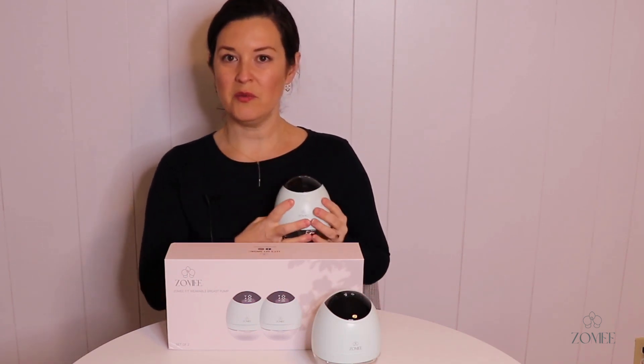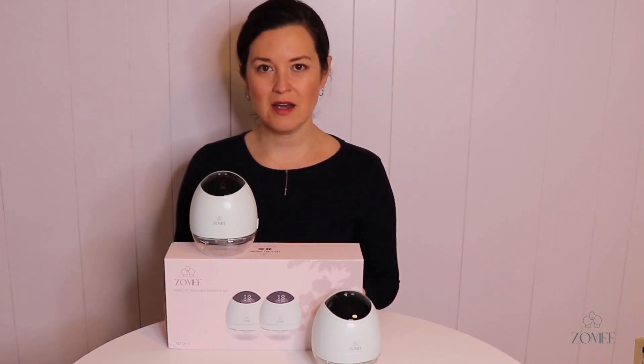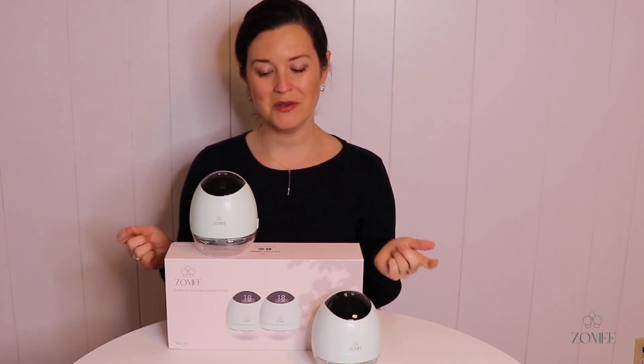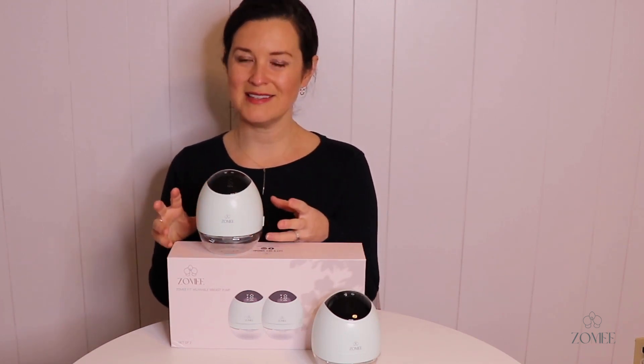It's a slim pump — you can wear it right in your bra, hands free. The battery life lasts up to two hours before you need to charge it, and the pump comes with two charging cables so you can charge both at the same time. It also has a memory function that remembers the last setting you used.